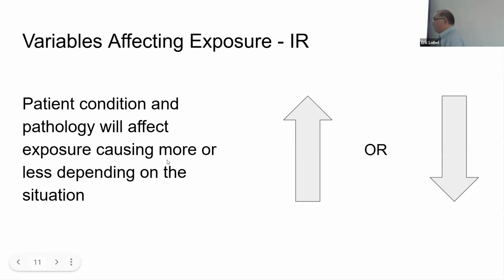So pathology is definitely an or, right? We had that long list at the end of last semester where you had to try to remember some of them. My favorites are like ascites, which is a buildup of fluid. Obviously, you need to increase radiation, right? If you have some kind of mass or tumor and you know about it, it's on the requisition, you need to increase. If you have osteoporosis, you need to decrease because the calcium content is lower. In other words, the pathology is either known as additive versus destructive.